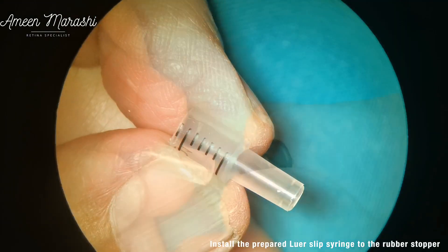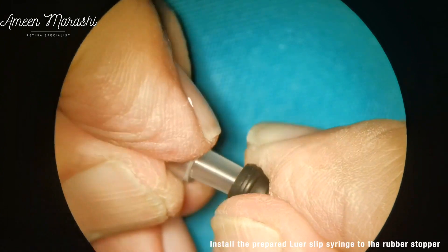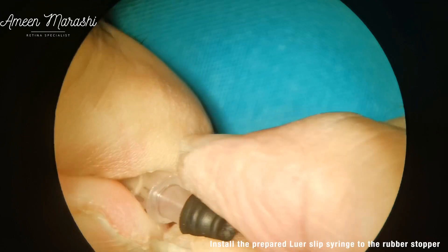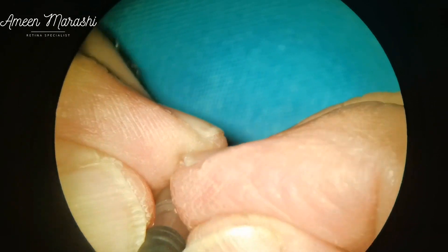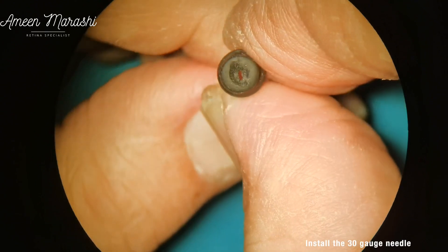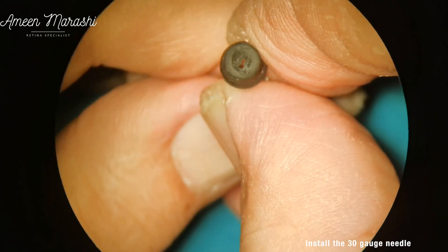Now the rubber stopper is installed to the prepared plastic luer slip. Then the 30 gauge needle passes through the hole made earlier in the leading ring of the rubber seal. Then the plastic luer slip is fitted to the plastic part of the 30 gauge needle. The exposed part of the 30 gauge needle should be only 1 mm.